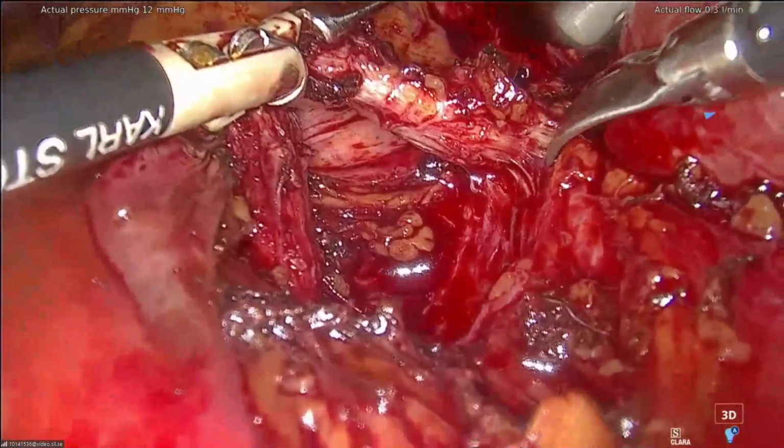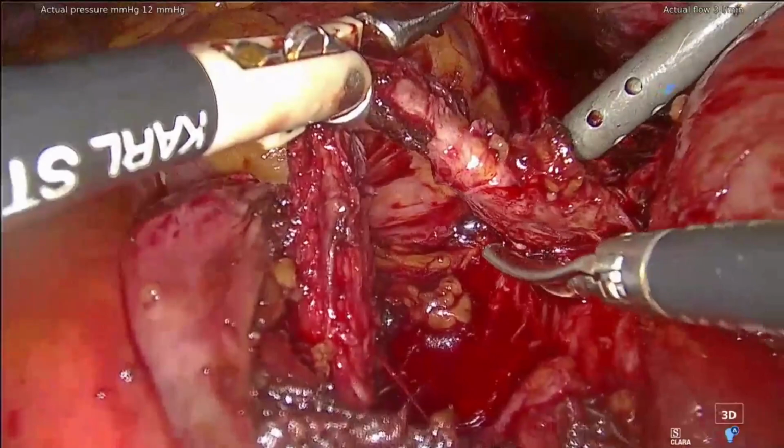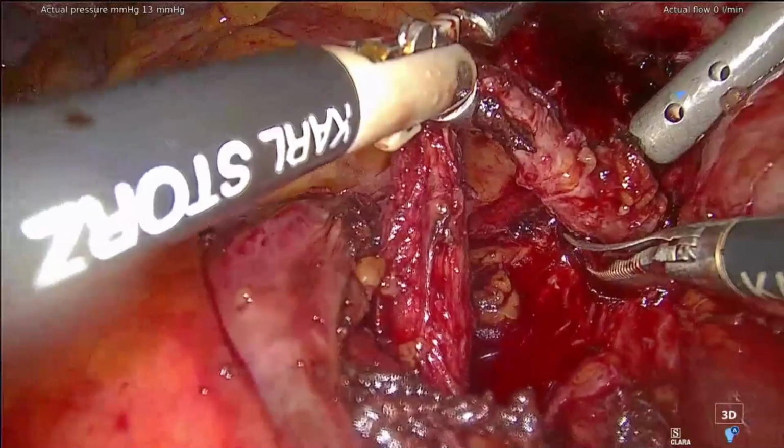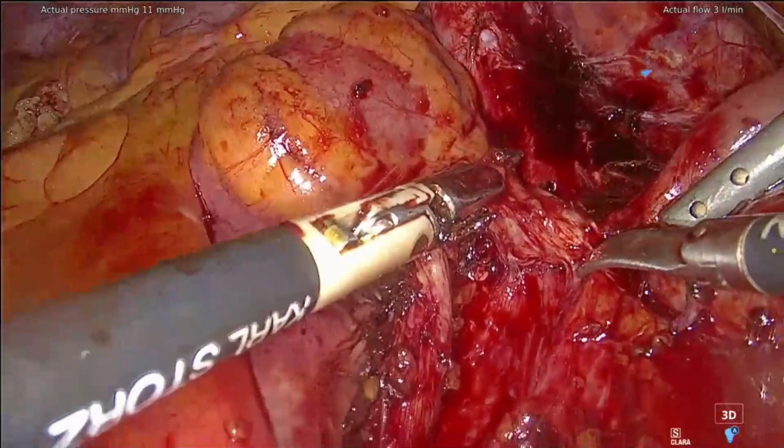Yeah. This patient was also treated with two endoscopic surgeries before to try to solve the problem of the stricture. Do you think that this is reasonable to be the first approach, or can we treat the patient directly with surgery, the redo surgery in a laparoscopic approach, for example?